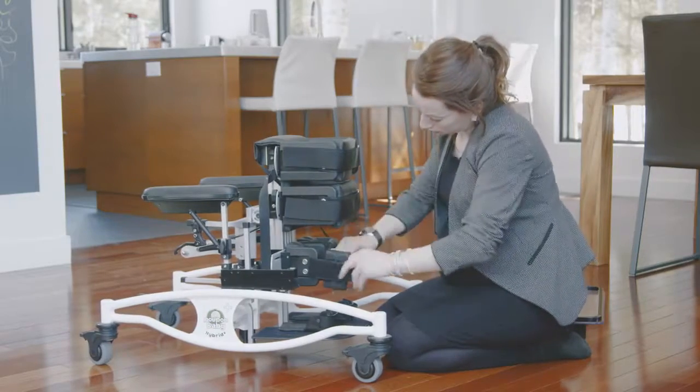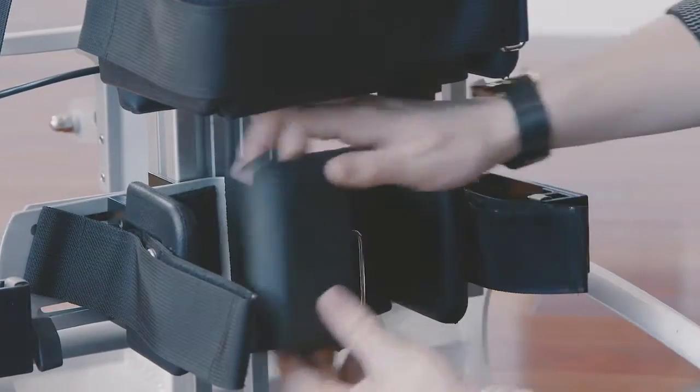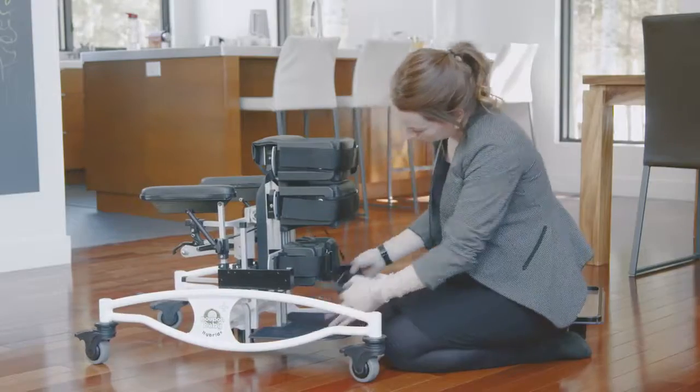Switch the position of the padded knee support and reinstall the Velcro. Then reverse the foot sandal direction and pivot positioning as needed.